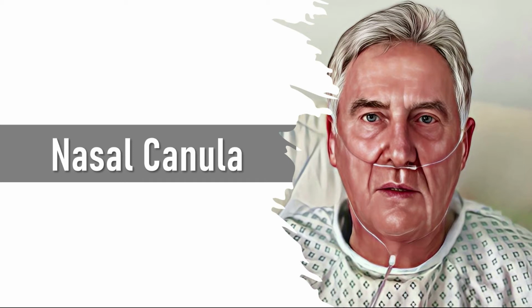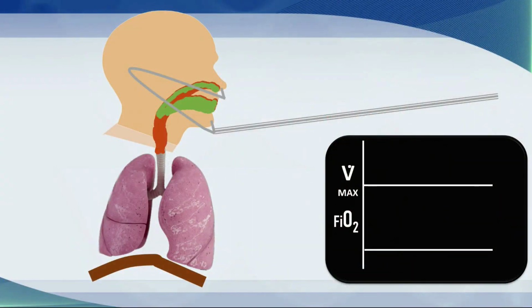At higher flow levels, it becomes quite irritating for the patient. So generally, we use moderate levels of flow, up to 6, perhaps 8 liters of flow. Beyond that, we think about using something else. Let us administer supplemental oxygen through nasal cannulae.